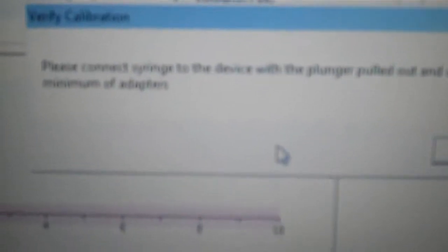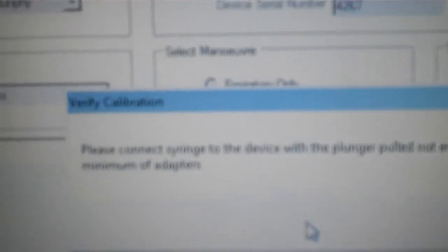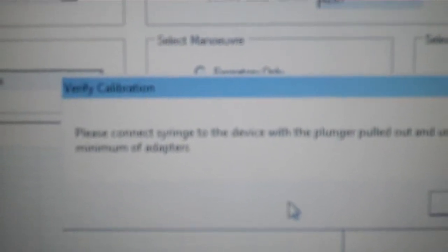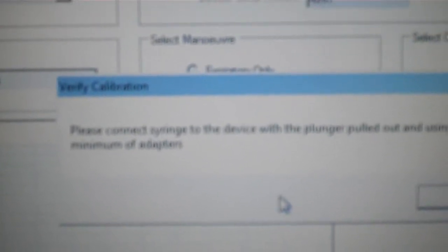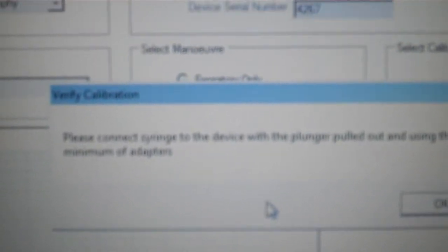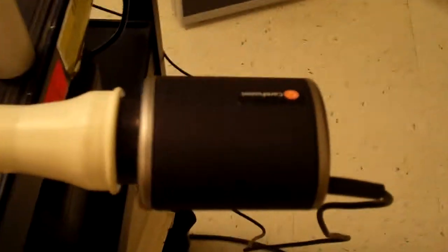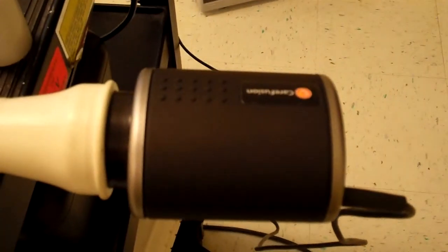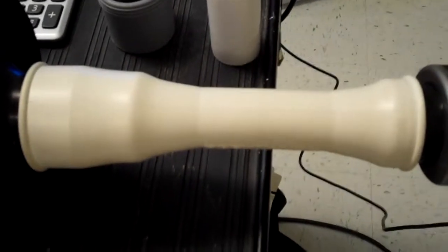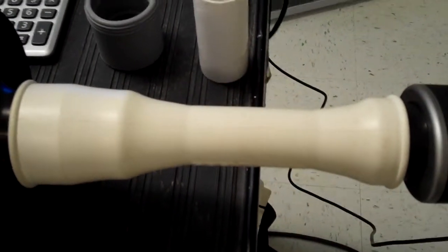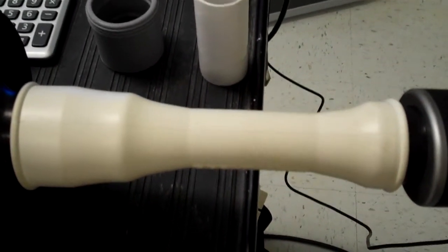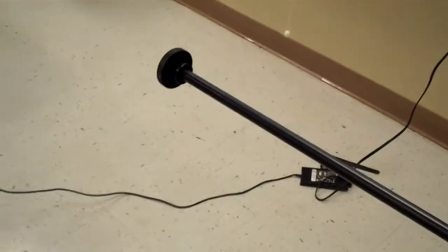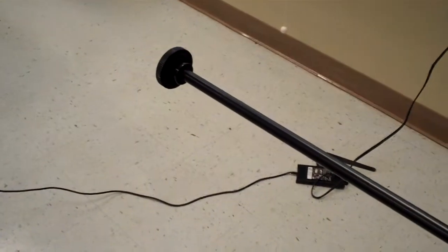It says here to please connect the syringe to the device with the plunger pulled out using the minimum number of adapters. Over here you will notice I have taken the flow sensor, which is the turbine. I have used our multi-purpose adapter and it is hooked up to our 3-liter syringe in which the plunger has been pulled completely out.